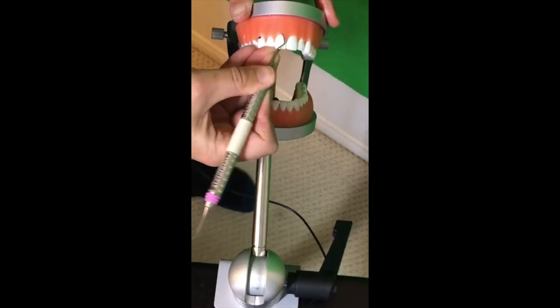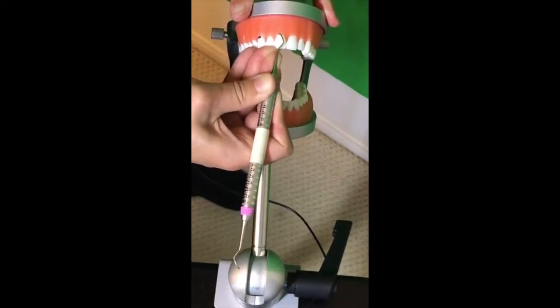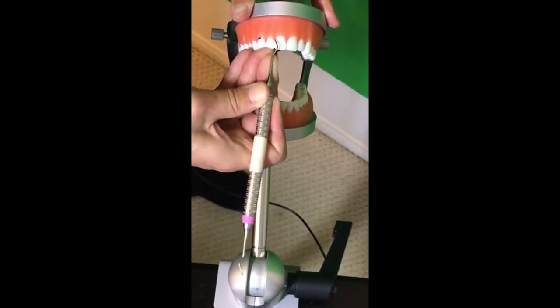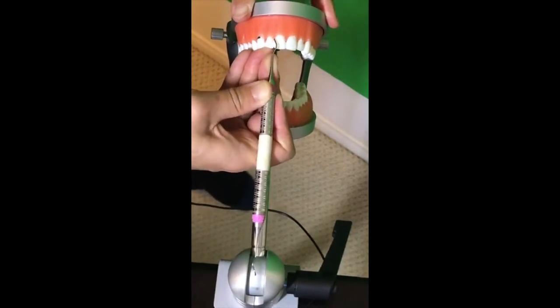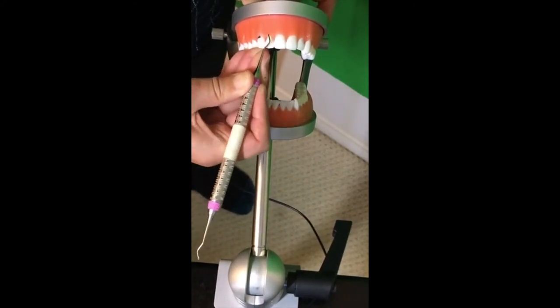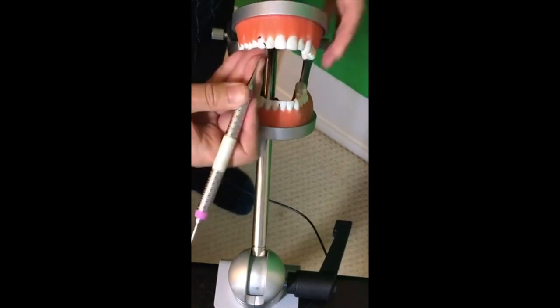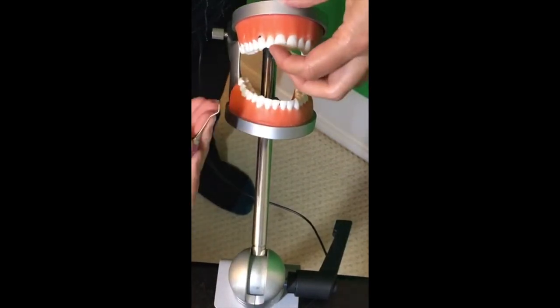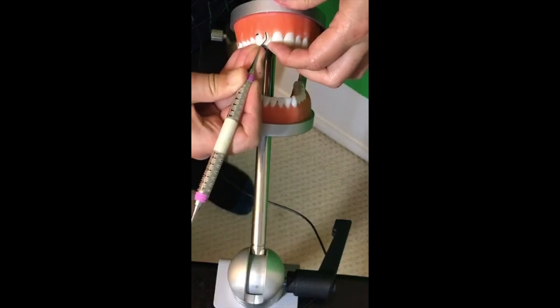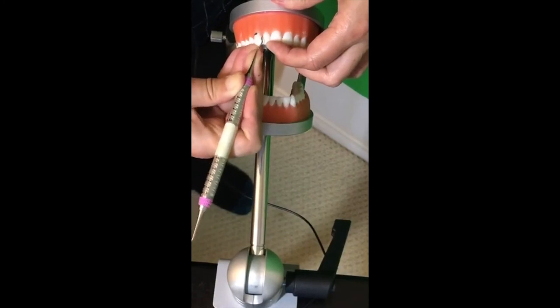Going around, staying fully adapted. This is the surprise tooth — it's mobile! When that happens, if a tooth is mobile, hold it down and then go around the tooth. Honestly, I have done that before — the tooth is mobile, you hold it down and scale around it. That happens in the clinic on real cases too.